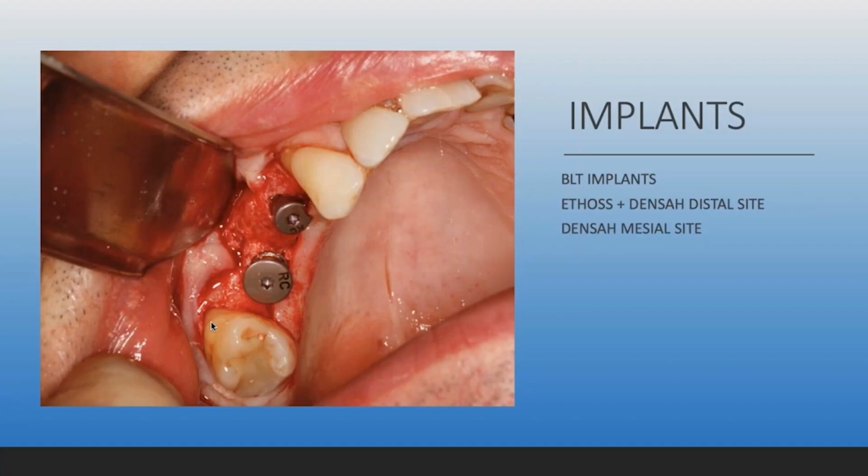You can see this picture, I think, illustrates slightly better than the previous ones that angulation thing I was talking about. You've got so many different angles to think about here. We're looking at tissue level implants again. No, sorry, we're looking at bone level implants, but we're looking at two different angles here.